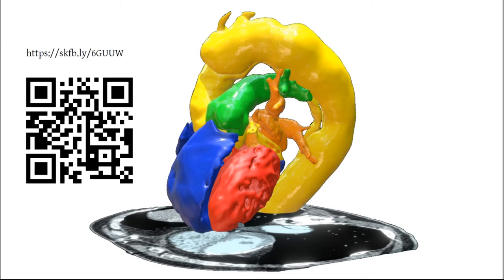But you can kind of position each one. So this one would be there. So you can see the aortic outflow and the mitral inflow. These don't actually fit. It doesn't actually fit, no. You can sort of do the chambers one at a time. Great. We're going to make another version that does fit together.